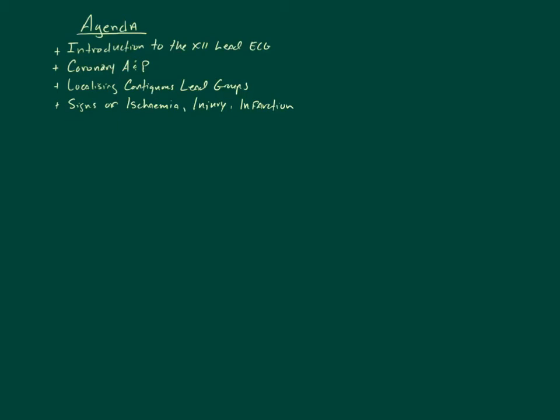Hooray! All right. So what we're going to talk about today is an introduction to the 12-lead ECG. Now we're going to move beyond rhythm strips into 12-lead. And at the end of the class, you guys are halfway through this course already. By the end of the class, we will have to marry both rhythm strip analysis and 12-lead ECG analysis.